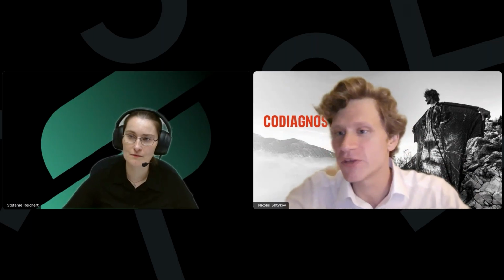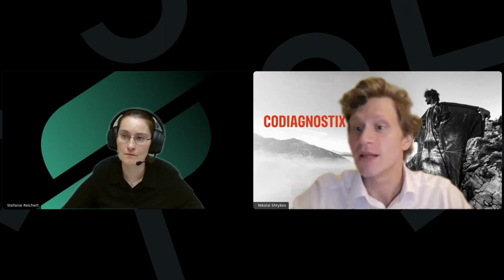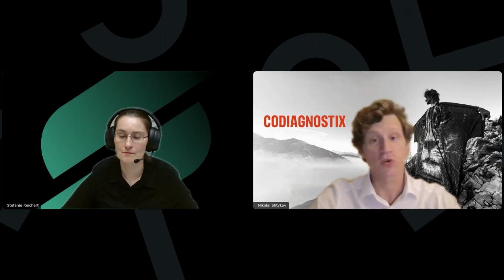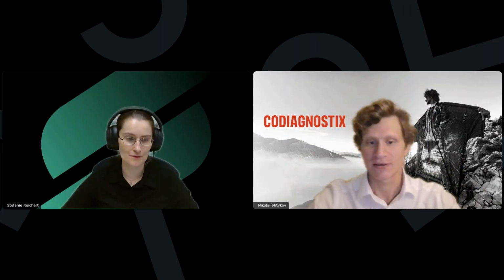Yes, can I please see the guide of the most other one? So which one do you mean? The guide for transferring the key cage, or which one? I'm sorry, I didn't get the question fully. Yeah, I think he wrote yes, so that was the one.